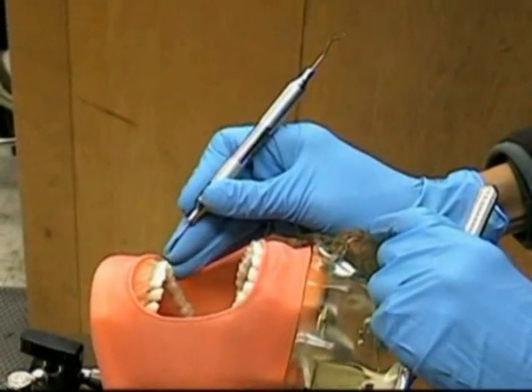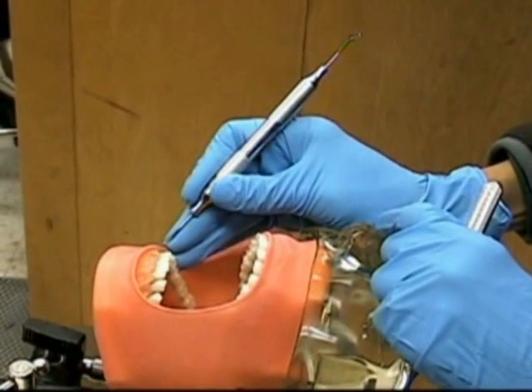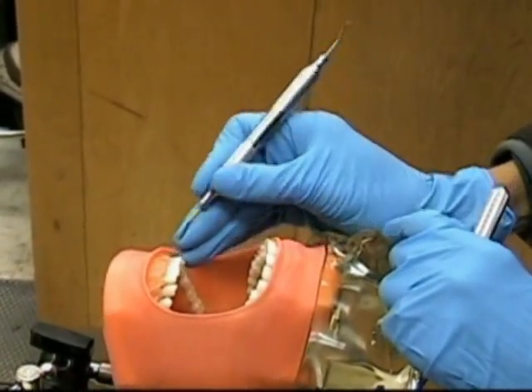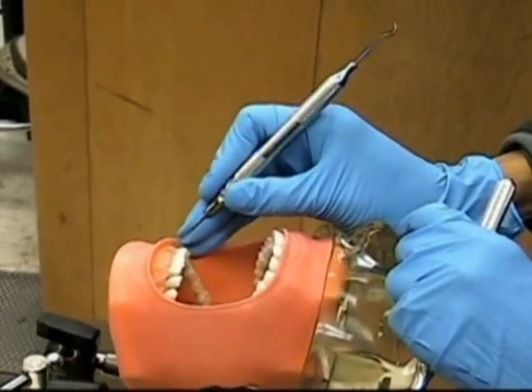Surfaces away from you. Sit behind the patient. Start at the midline.